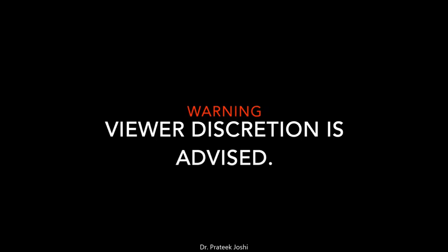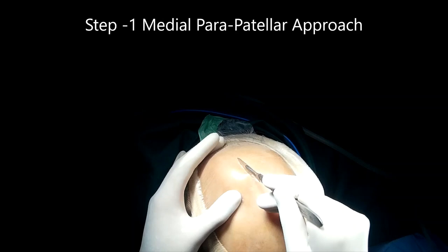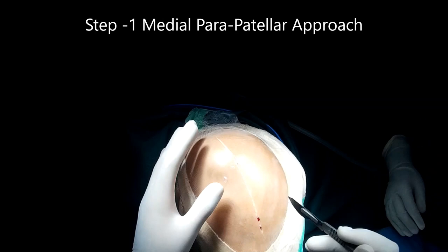The purpose of this video is strictly educational. Viewer discretion is advised. We begin the knee replacement surgery after the patient is positioned supine on the operating table and tourniquet has been inflated.